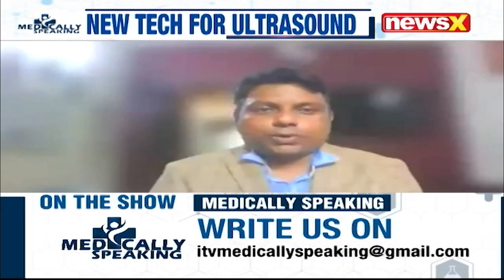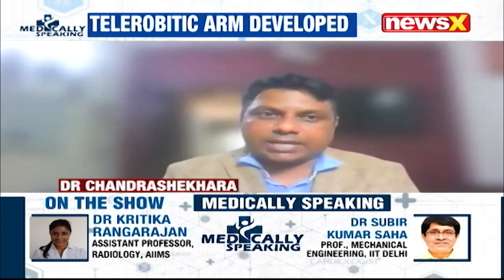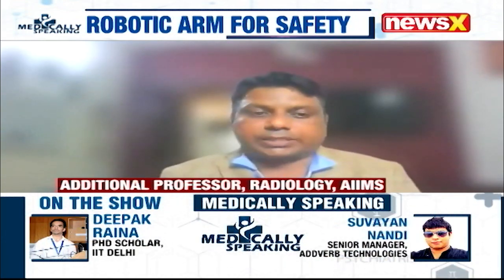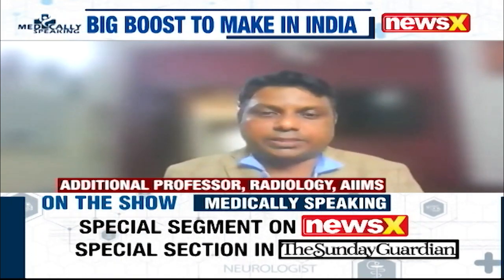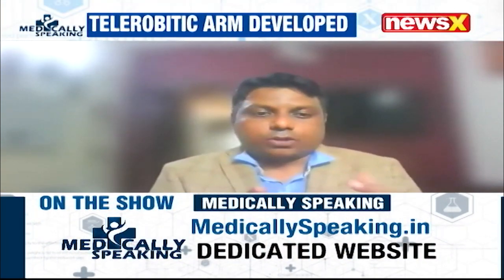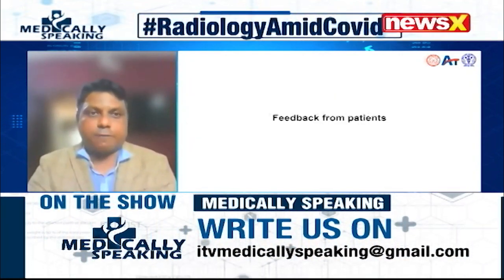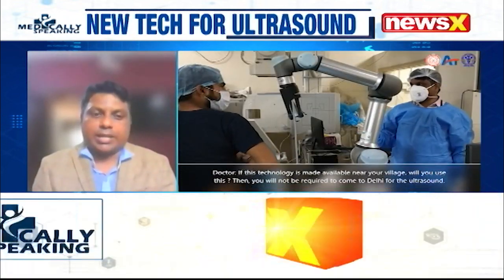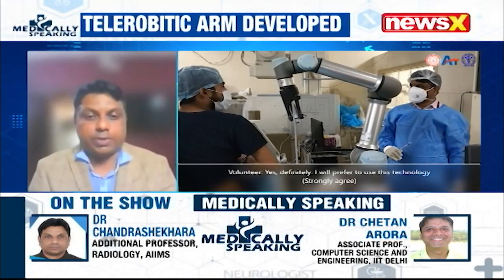Well, ultrasound, as you know, is a very routinely used modality. It is fast, accurate, and gives the diagnosis immediately. It is one of the most commonly used modalities in the emergency hours. While doing the ultrasound, the doctor stands in close contact for a longer duration with the patient, which was a lesser problem until this COVID-19 pandemic hit the world. We realized that close proximity of the patients with the healthcare workers tends to increase the chance of infection to the healthcare workers.